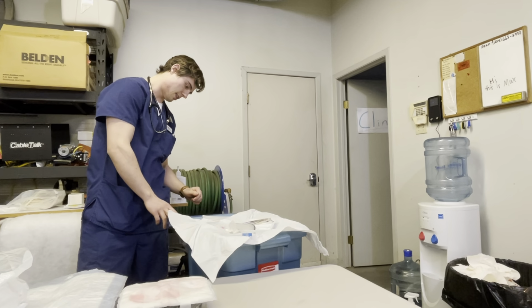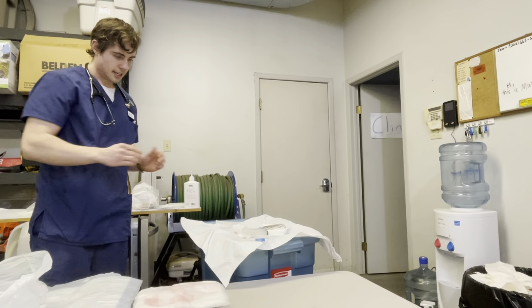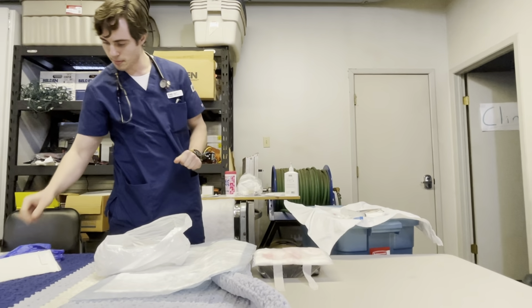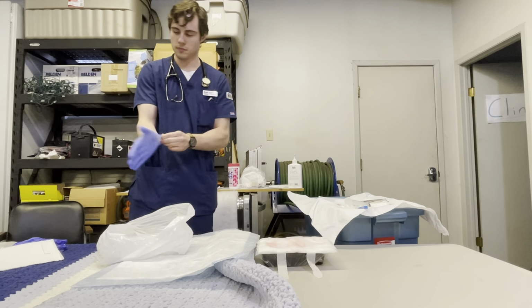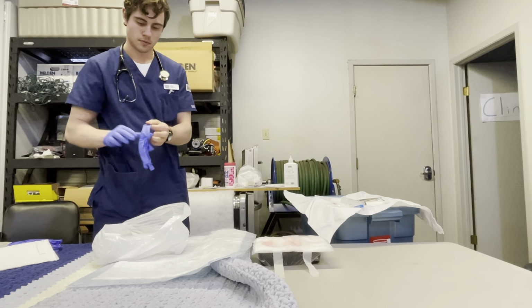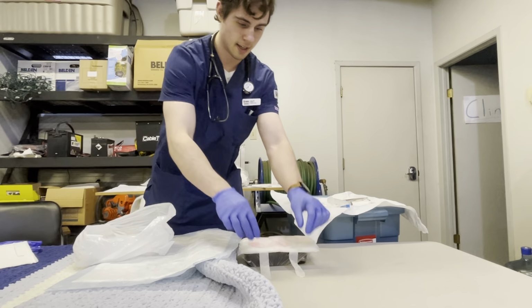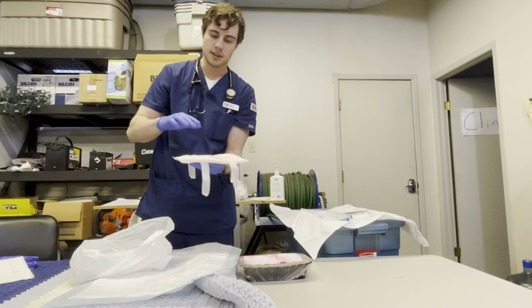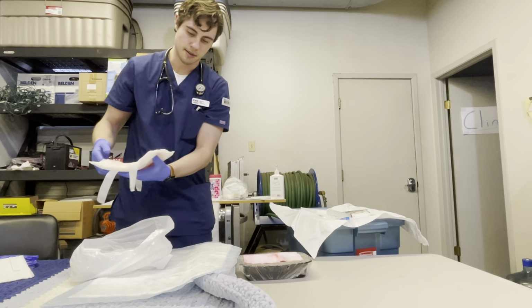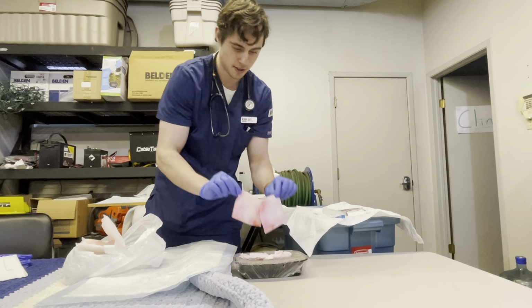So next, I'm going to do hand hygiene. I'm going to put on clean gloves. And I'm going to start by taking off the old dressing, noting we do have a moderate amount of serosanguinous fluid on the abdominal pad. Throw that out. I'm going to take off the old 4x4s.